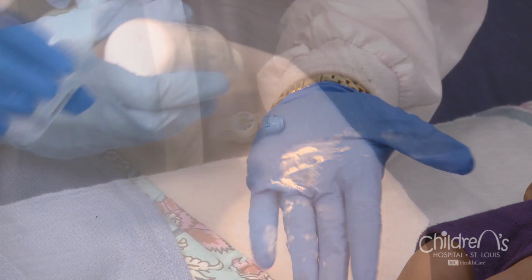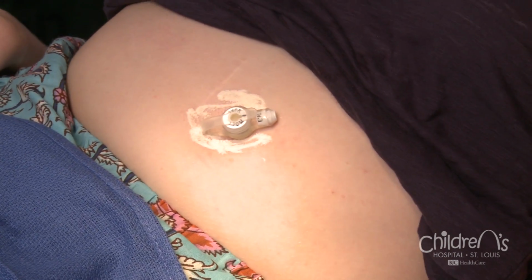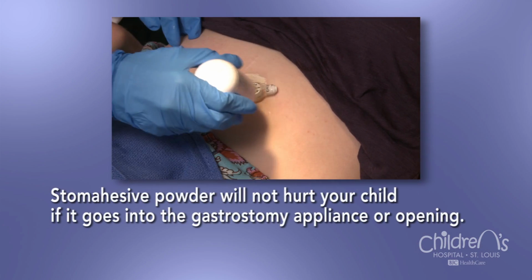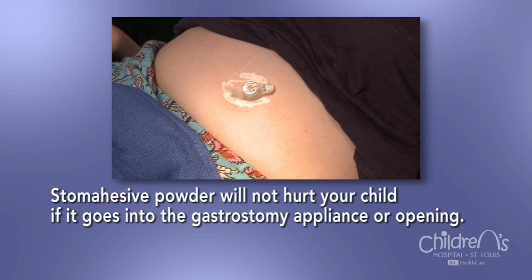Just sprinkle stomadhesive powder around the gastrostomy daily after bathing your child. You may also use a piece of gauze over the powder to absorb additional leakage. Stomadhesive powder can be sprinkled around the button and will not hurt your child if some of the powder goes into the gastrostomy appliance or stomach. Moisture may cause a rash. If the bumps or rash do not clear up after using stomadhesive powder, call the surgery office. There are other dressings available to help with irritation. Call the general surgery office for advice on other products that can be used.